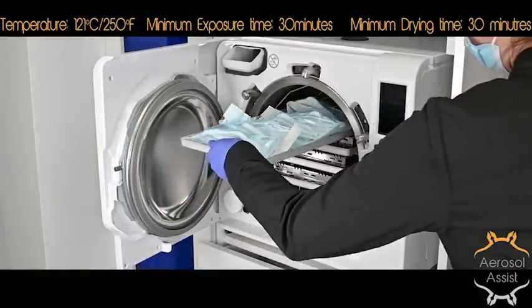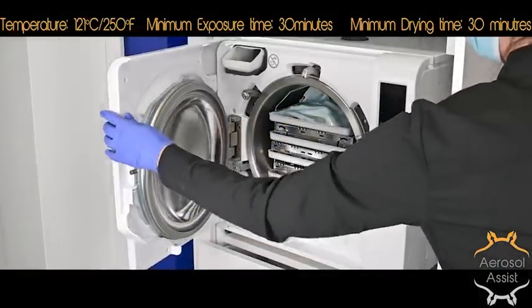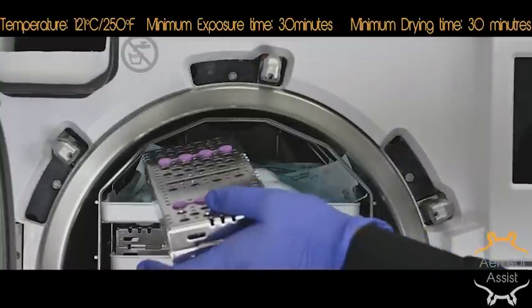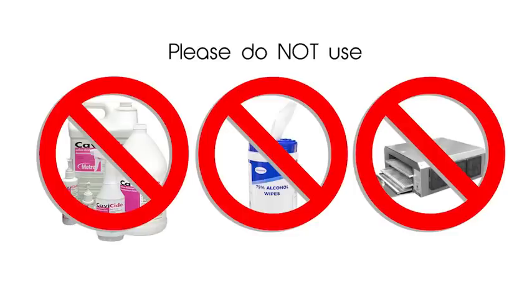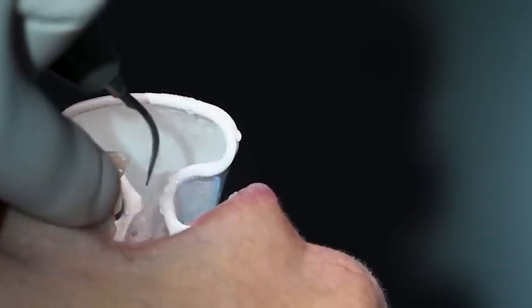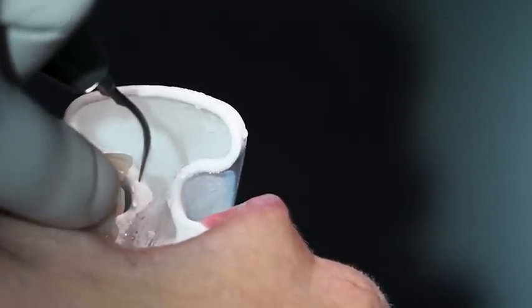Load them single file on the autoclave tray and insert the tray in the top slot only. It's important to not place any other instruments or trays on top, as this may warp the device. Do not wipe it down with alcohol cavity wipes, nor dry it in an instrument dryer prior to placing it in the autoclave.